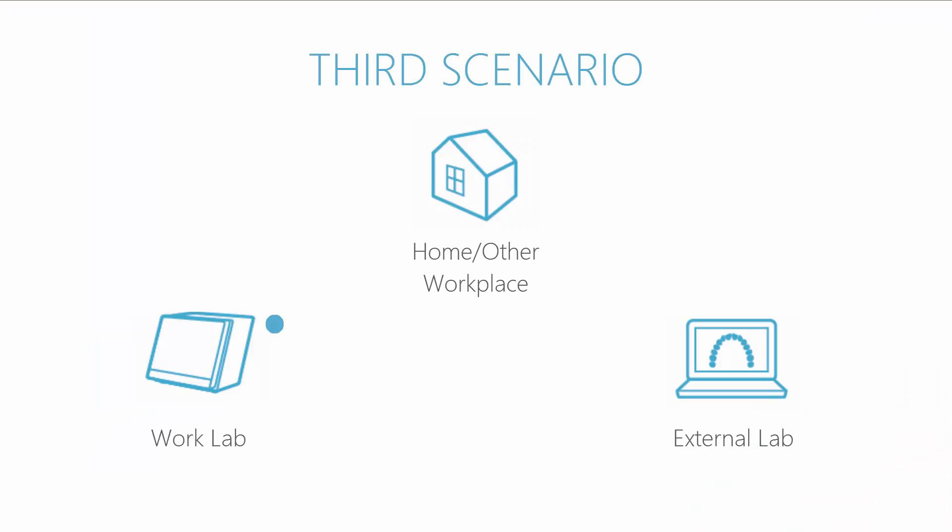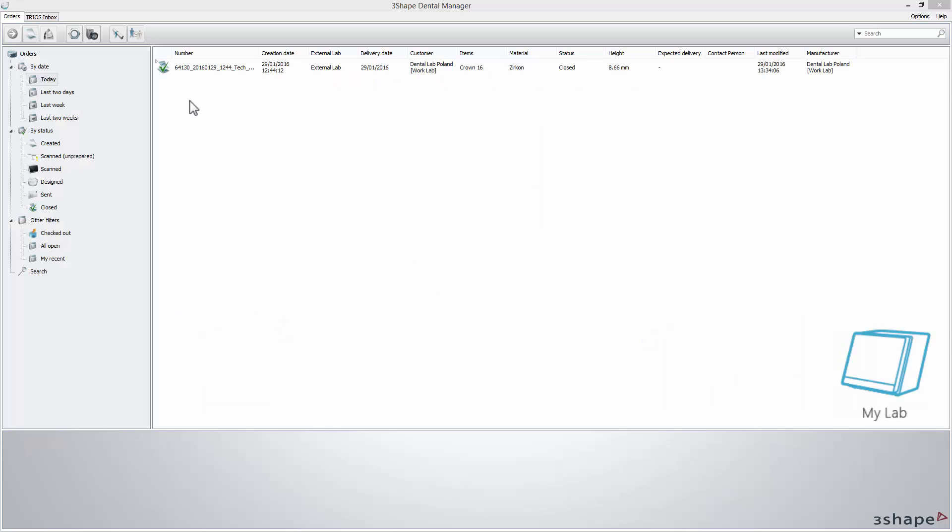Now, imagine that you wish to start doing the design at work, then skip it and simply send it to your home PC or other workplace, where you can proceed with further design steps, add some changes to a previously designed order, and eventually easily save a completed design.